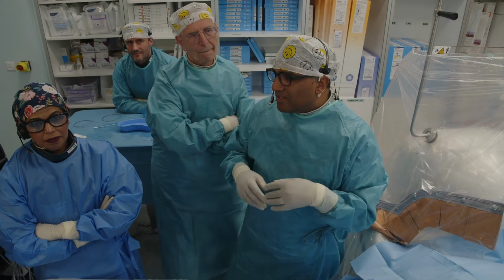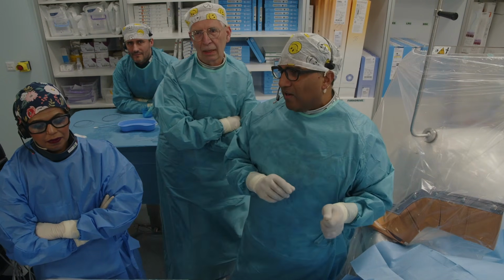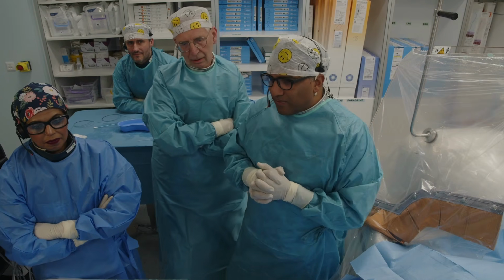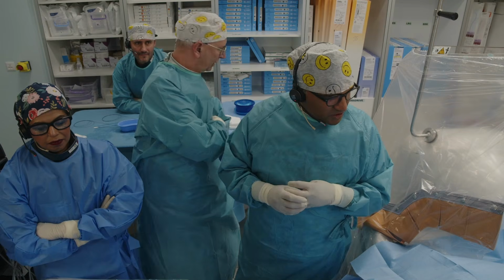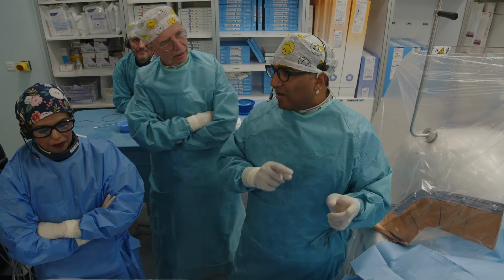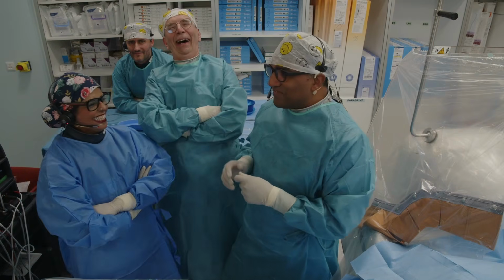So briefly, we have a patient with a previous myocardial infarction, and what we want to do is to get pericardial access with a special tool called the Pericross device. There are two interesting things that are going to happen at the beginning of the case. Number one, we want to get pericardial access. And number two, Peter said he's not going to say a word during this. We want to see if that's going to happen.